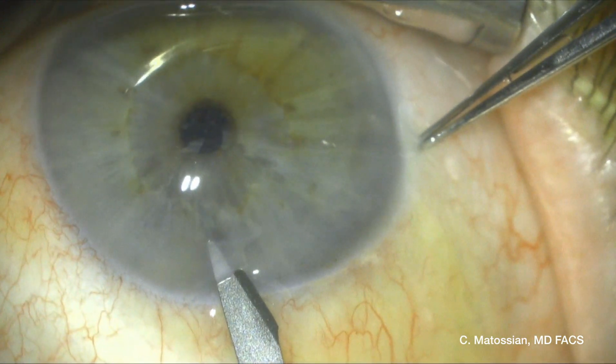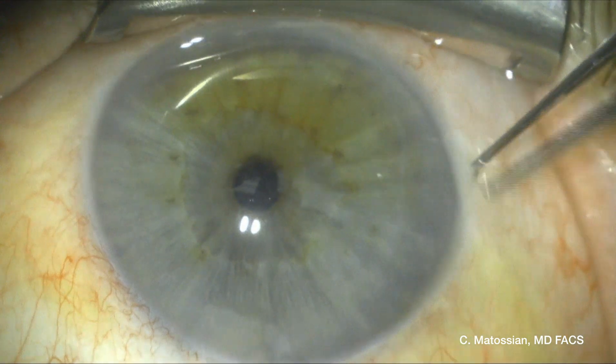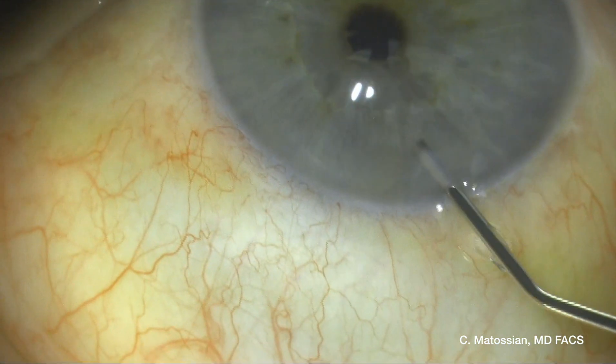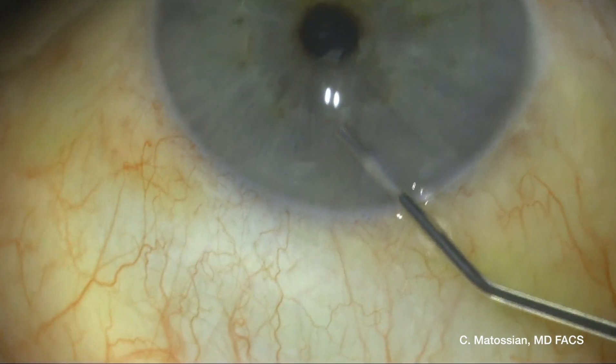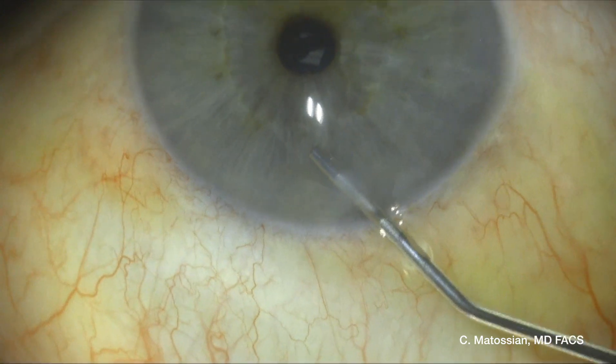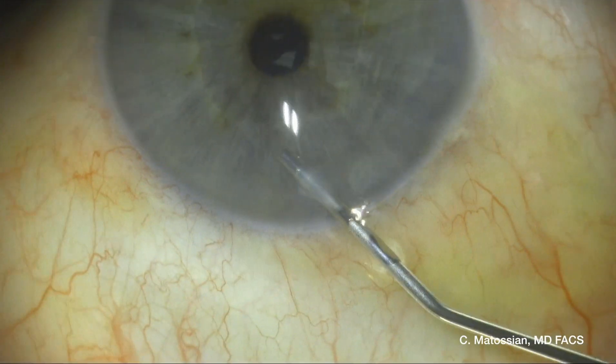I had to take him back to the operating room in order to remove it. I'm going into the same original side port incision, and using a viscoadaptive OVD, I'm sequestering the nuclear fragment in order to avoid it from being moved around in the anterior chamber.